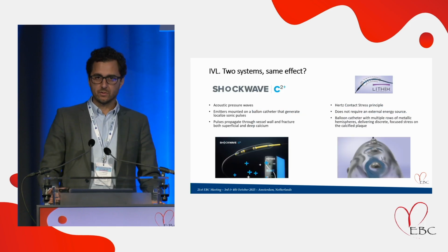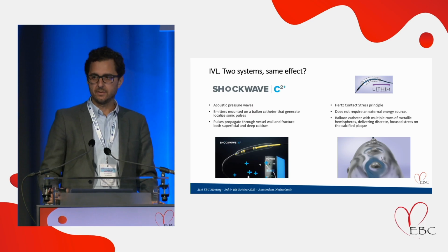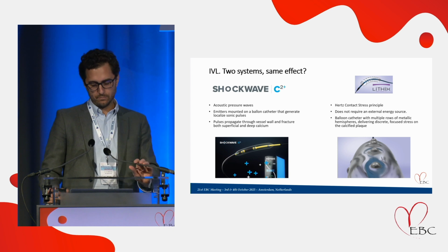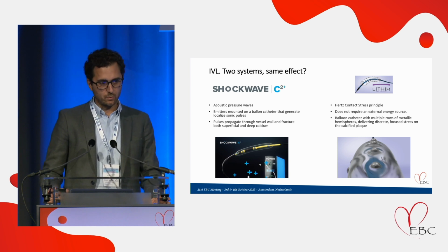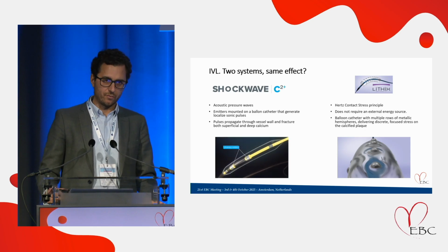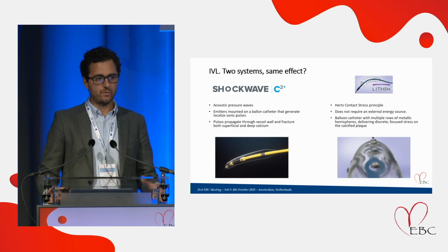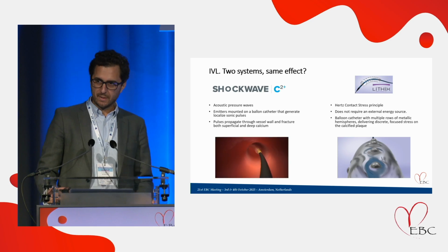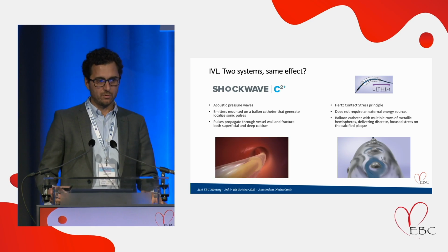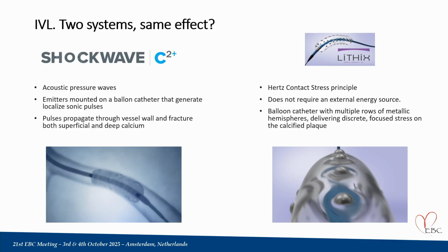We talk about intravascular lithotripsy, and we have currently two systems, there are others, of course, but these are now prevalently used in the world. One is Shockwave, with extensive experience already, a bunch of information and data already available in different scenarios. It's based on a system of acoustic pressure waves generated by emitters mounted on a balloon system, able to generate these sonic pulses which are transmitted through the vessel wall and selectively target the calcification and generate cracks within the calcium, right?